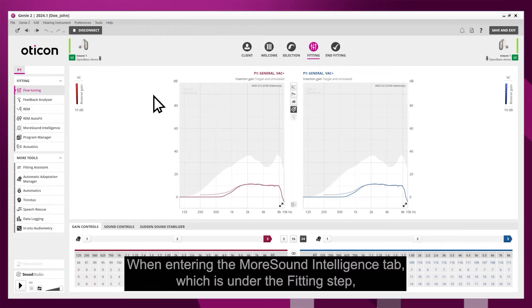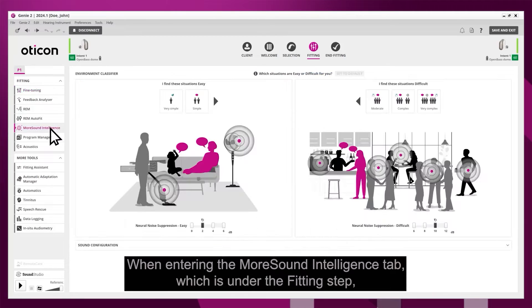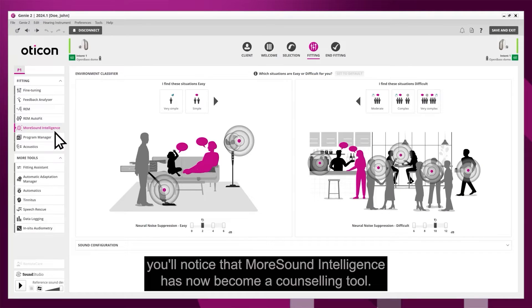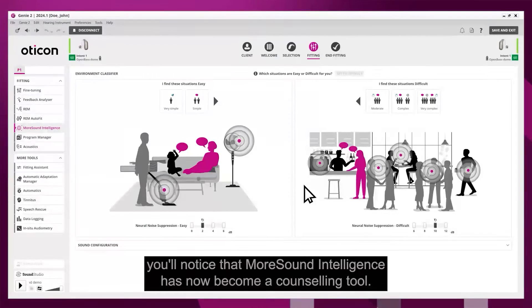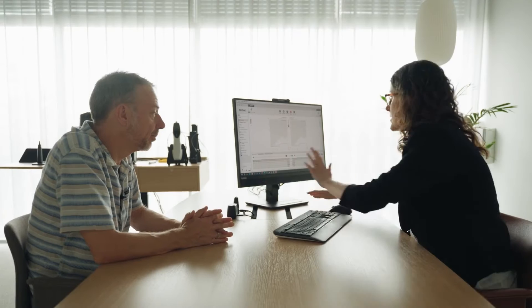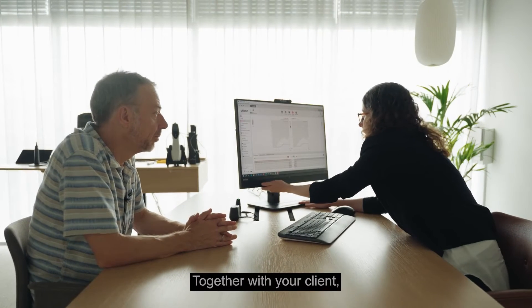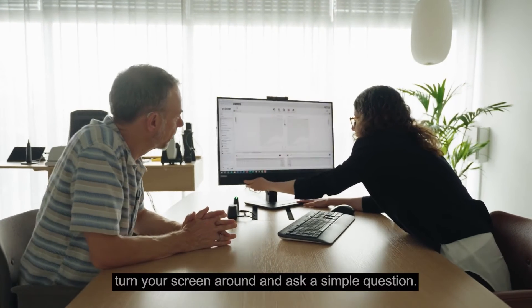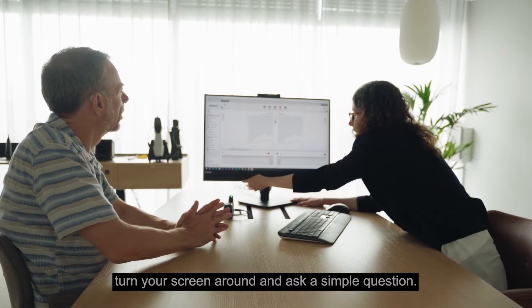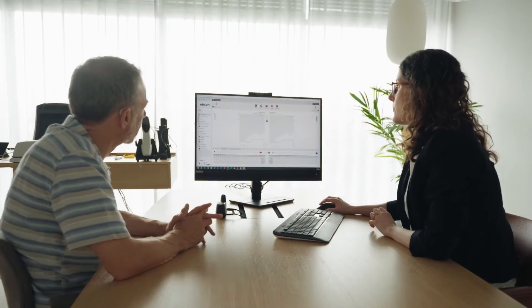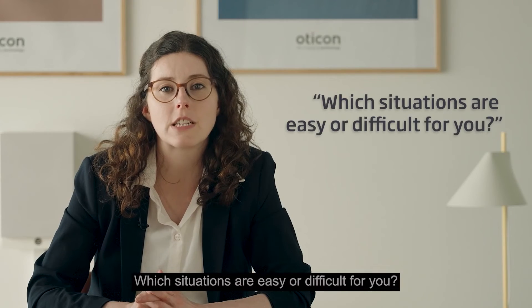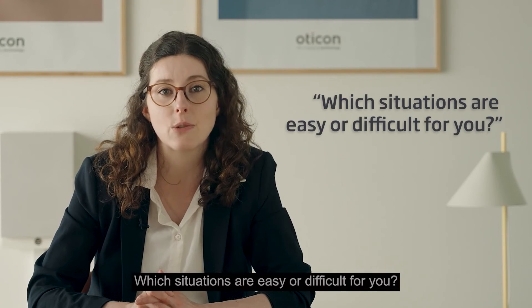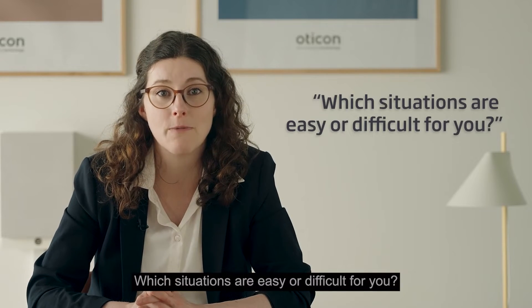When entering the Moresound Intelligence tab, which is under the fitting step, you'll notice that Moresound Intelligence has now become a counselling tool. Together with your client, turn your screen around and ask a simple question: which situations are easy or difficult for you?